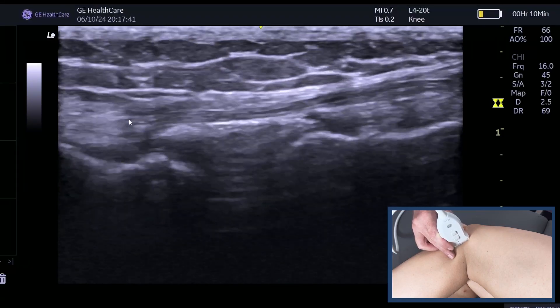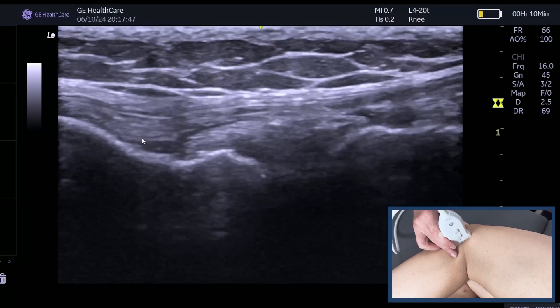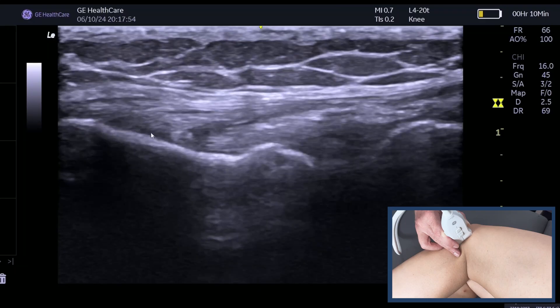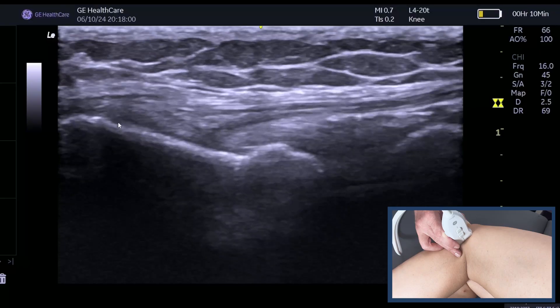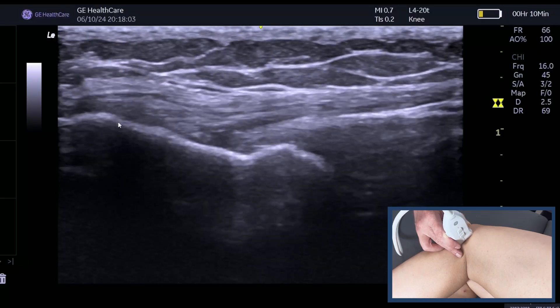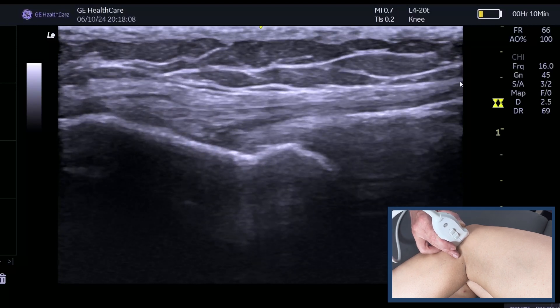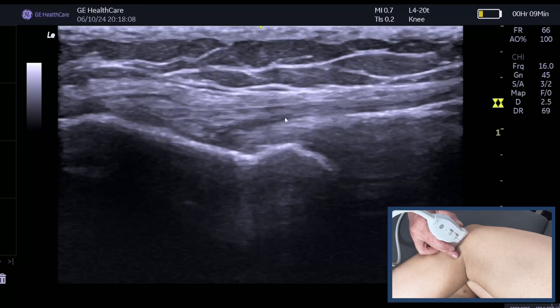Now remember it then passes over the popliteus. The popliteus here is oblique, so you're not going to get a lovely image because the knee's bent. And then you can see that nice fibrillar pattern and that attachment onto the femur here — so that lateral femoral condyle. And if I just hold that image there, I'm reasonably happy with that.